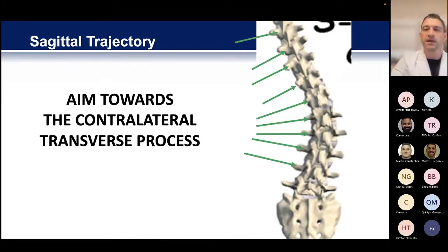So, the other thing is, people always say, how do I aim to make sure that my screws are parallel to one another? And I think a lot of you have heard me talk about, I don't care. I like my screws to look the same. It's not that one side is right or wrong, in other words, the right side of the table versus the left side of the table. No, it's more that you want the screws to look the same. So basically, if you have the left and the right side aiming at the same point, then they will typically very nicely align on X-ray.